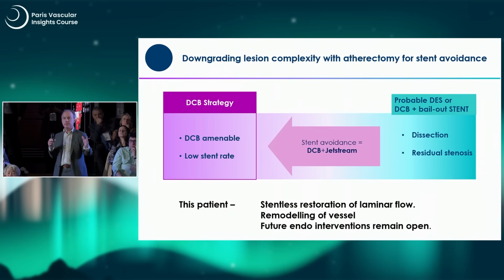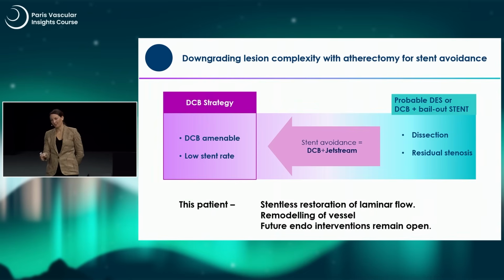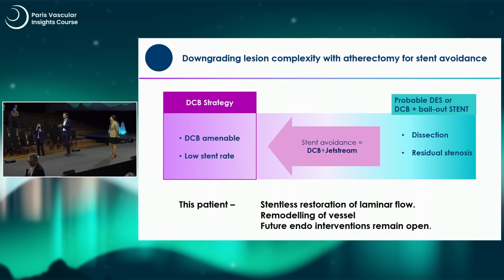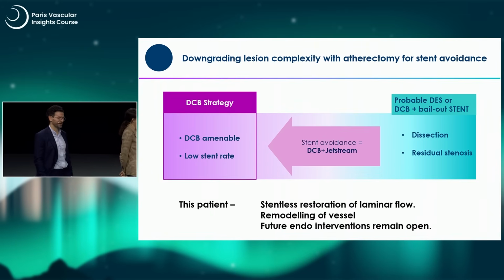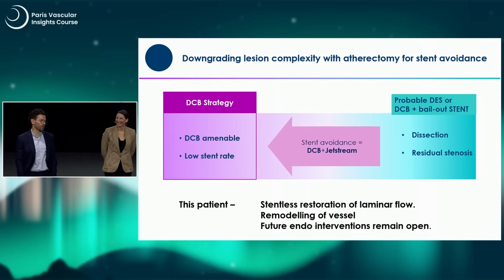I'm confused. You need to prep your vessel correctly. So it is depending on the vessel preparation. Once you've prepped everything, you do your angio. If you've got a good vessel prep result, then I think it's safe to use DCB. Correct. If you see that you've got residual stenosis or dissection, don't go for DCB plus bare metal stent. Rightly go to DES right away. Very clear. Actually, there aren't any contraindications using DCB plus DES. Exactly, the circle is around. No contraindication. So why not deploy an Eluvia after DCB failure or dissection or residual stenosis?